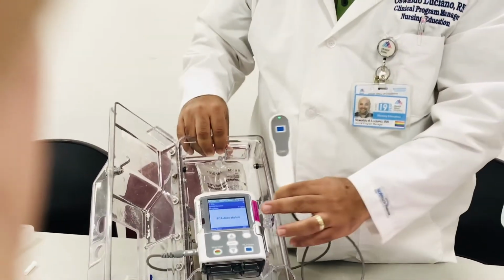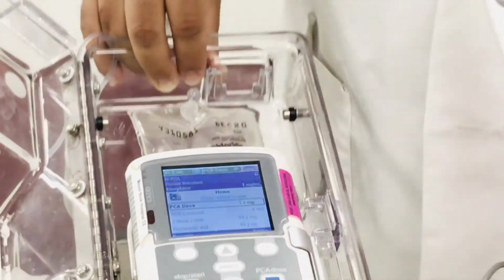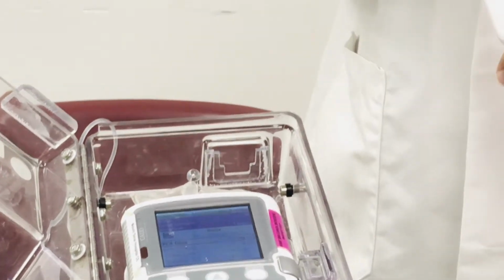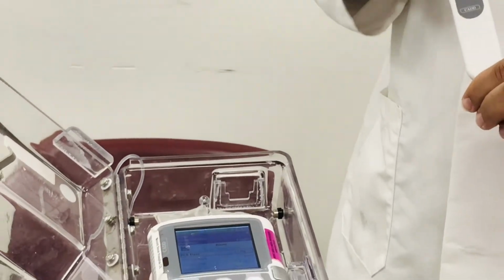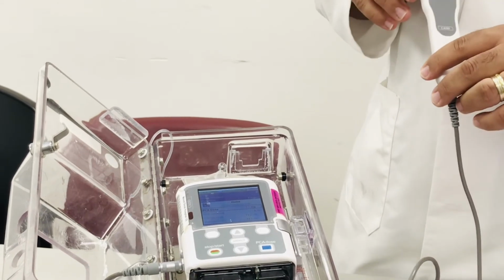So when you press a dose and a dose is given, it says PCA dose started, and now you have another 8 minutes before another dose can be given to the patient. Okay? So thank you very much for your time, and we'll see you in nursing education, where you'll get to play with the machines and get more comfortable with them.